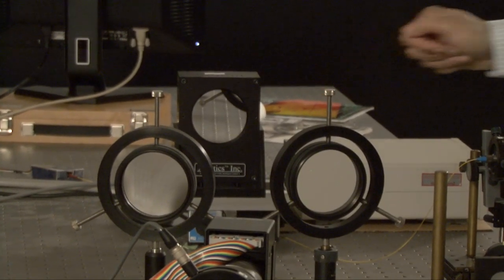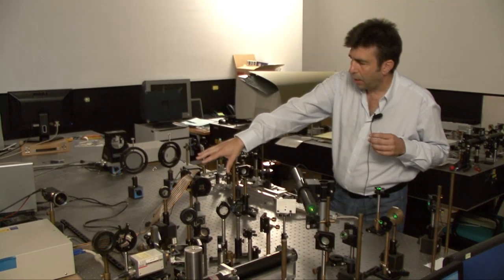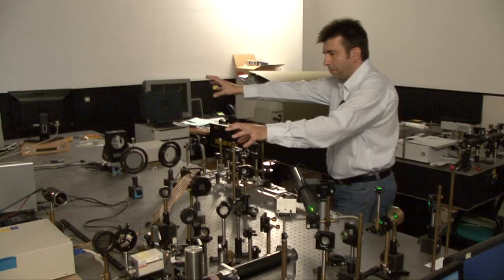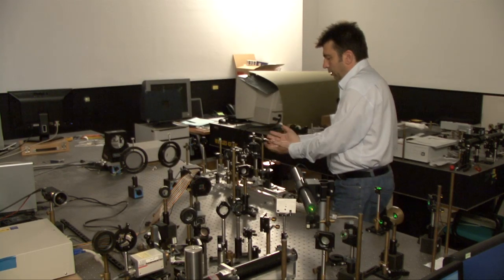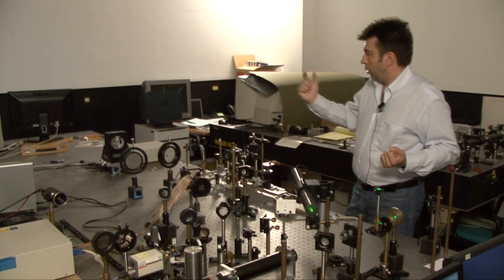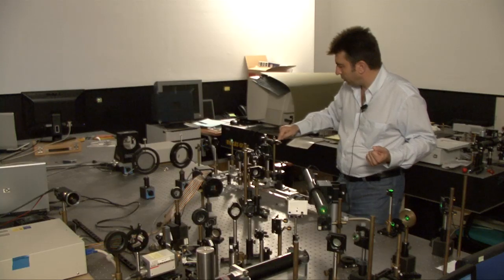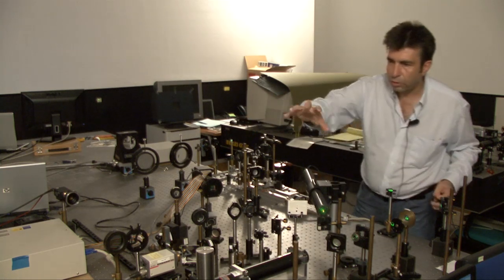It's a mirror whose shape you can change very precisely, and here a liquid crystal spatial light modulator. These two elements are optically conjugated with the eye pupil here, and they are inducing the optics we want to produce. To do this, we actually need an invisible laser coming to the eye, the light reflected back, going through the lenses and the mirror, and going to that sensor.